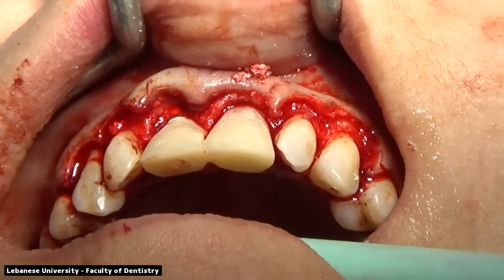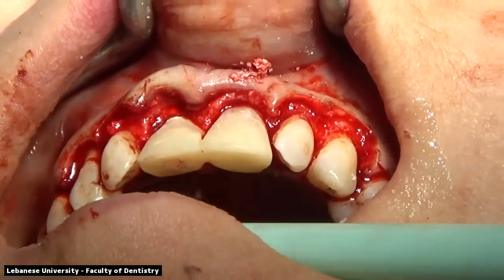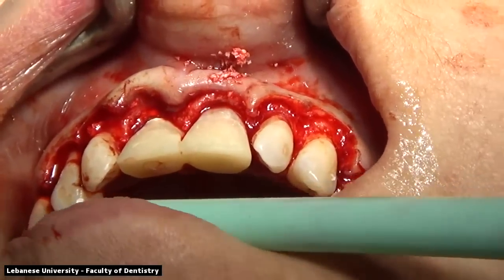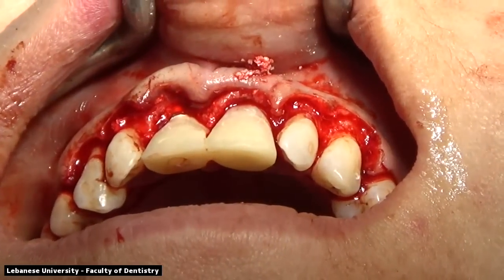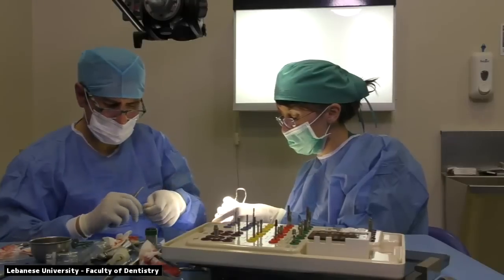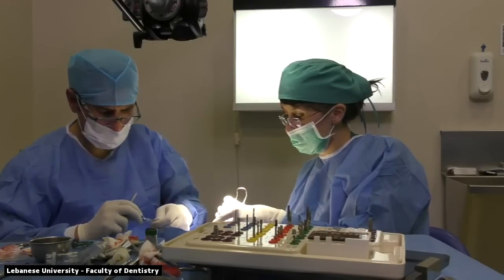We're looking for some suture material. Suture. We're using our Castro Viejo to suture the site. Polyglycolic material, resorbable. Polyglycolic material is a 14-day resorbable suture material. It will be used in this case. Simple interrupted sutures will be placed.